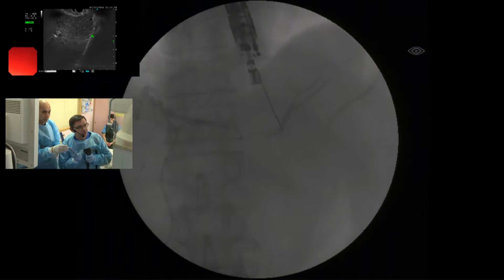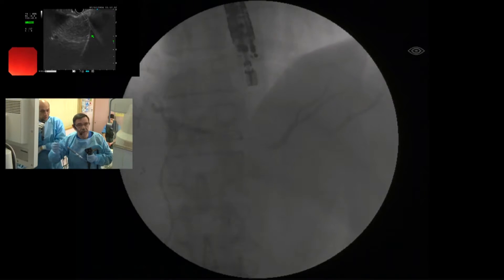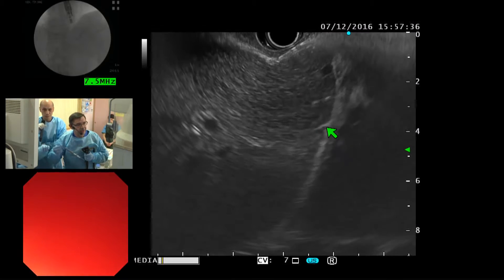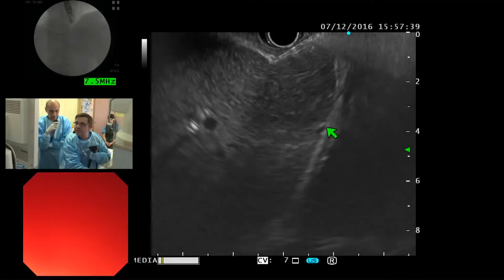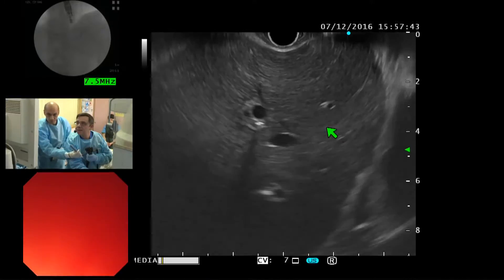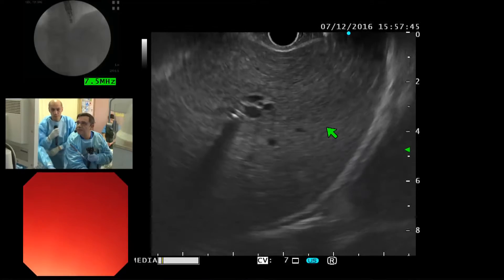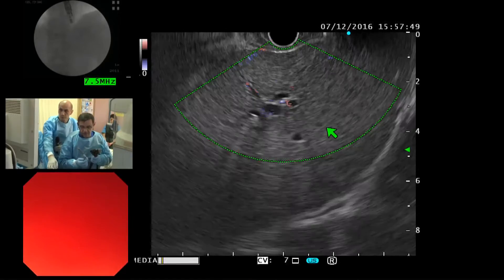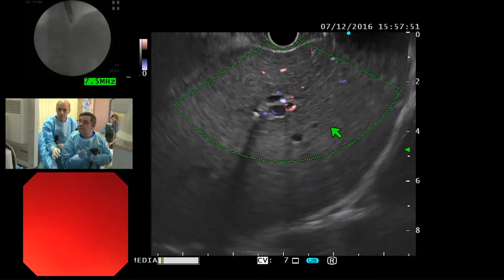I think I should remove everything and repuncture. The duct is very, very small. I will change my position. I don't see — yes, I think this is the duct. Okay, this is the duct.